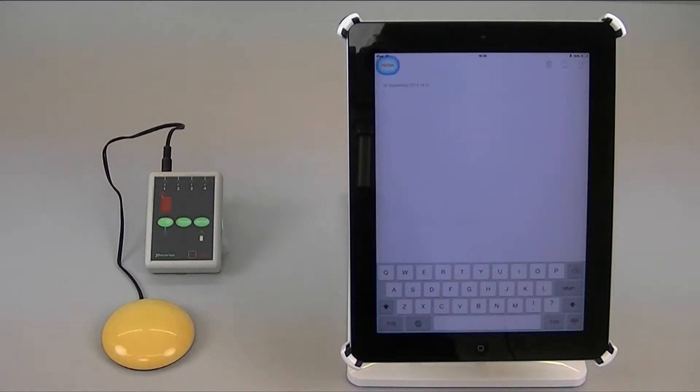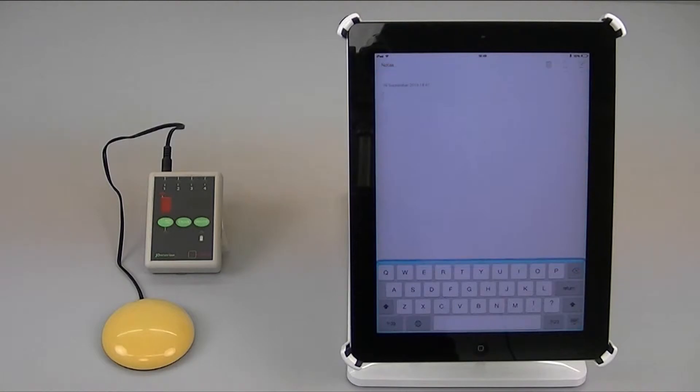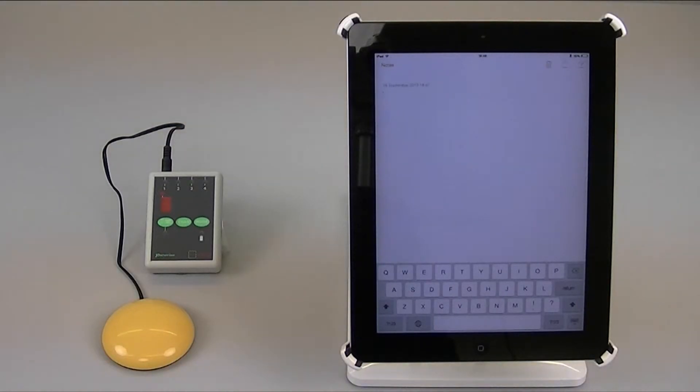One function which has been built into the operating system is the facility to double tap the select item switch. I currently have the applicator set with a single yellow switch which has been configured to be select item.